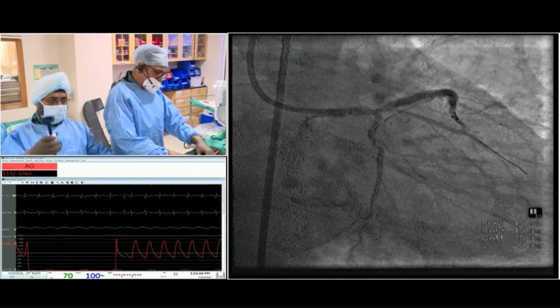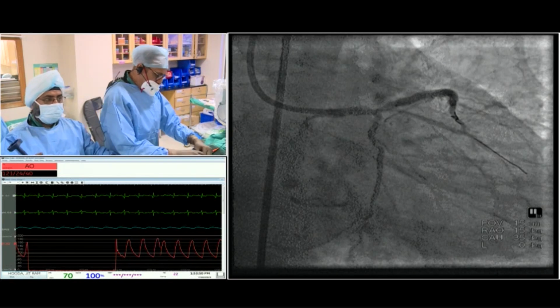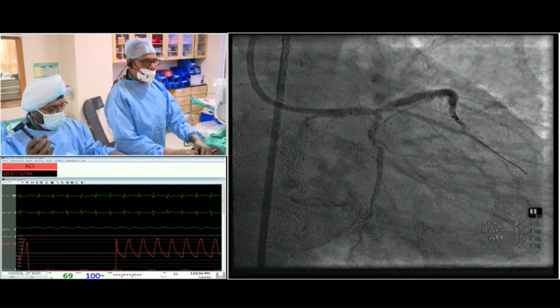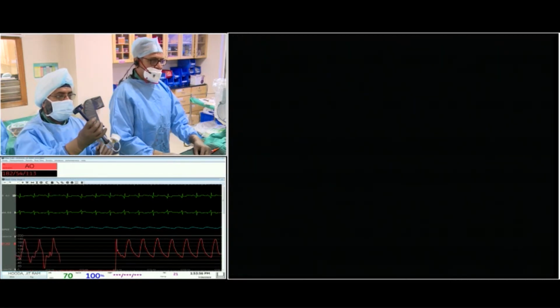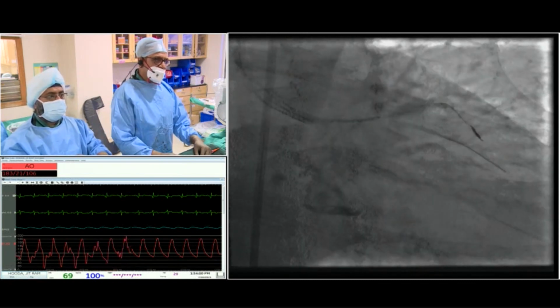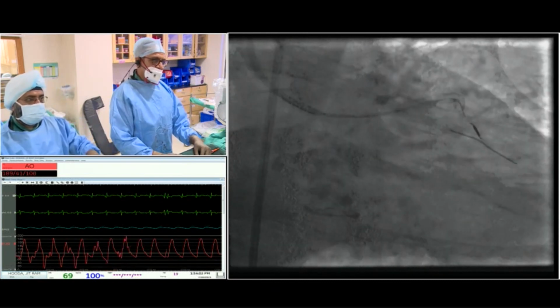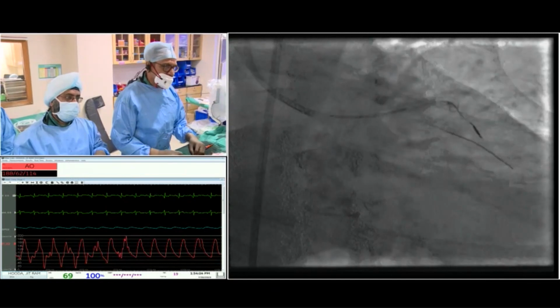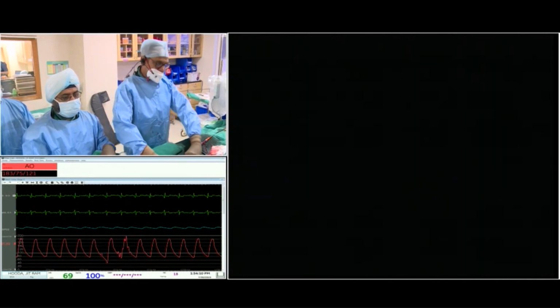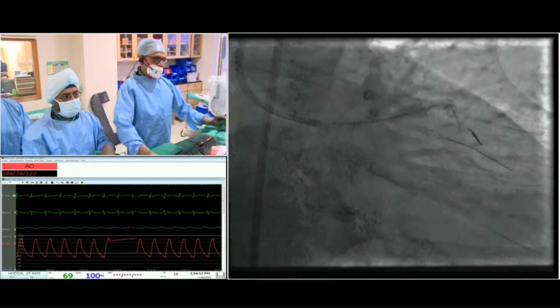So the plan is not to come onto the ostium. There are two schools of thought, Ajay. Some people recommend coming directly into the ostium and tackling everything, but the French say that if the ostium is free from disease, you can still get away by not doing it. What is your practice? The ostium is clean for me. I don't come all the way back as long as I have enough room to POT the left main, because I worry that you're going to stick out and there's no reason to do it unless you have to. But you do need enough room to POT.